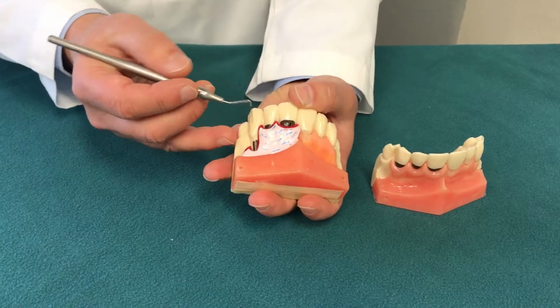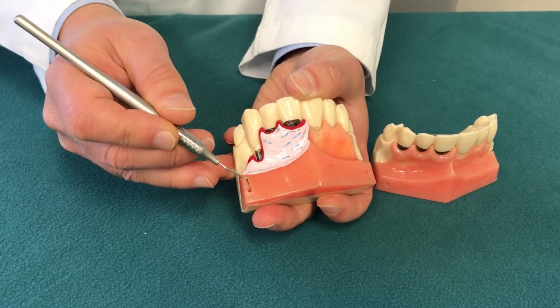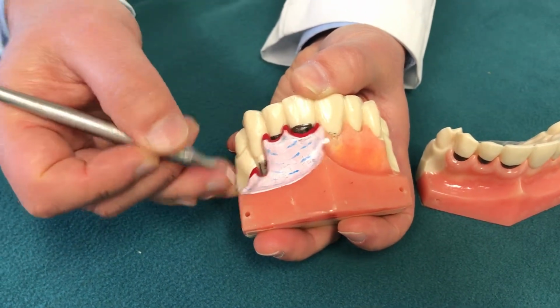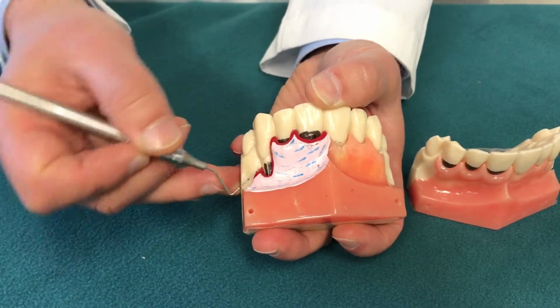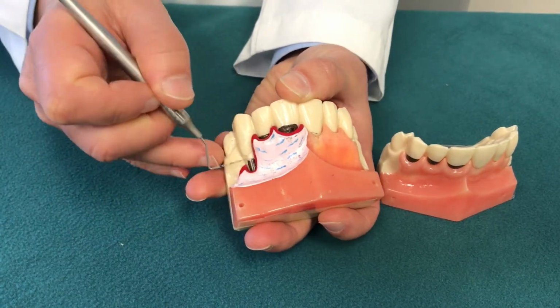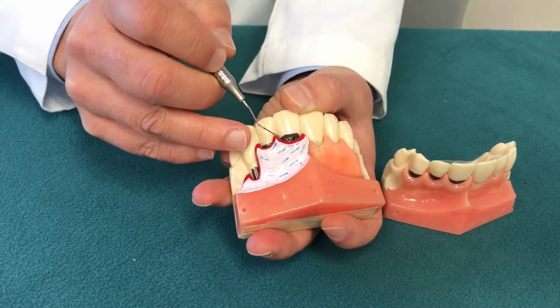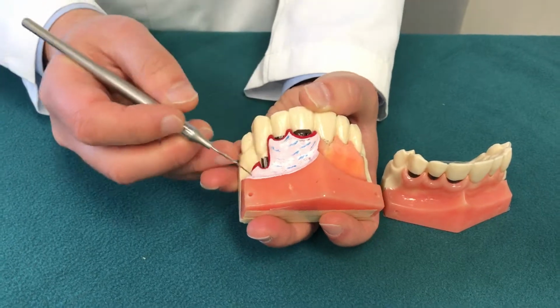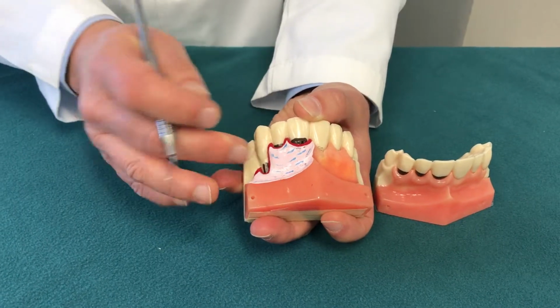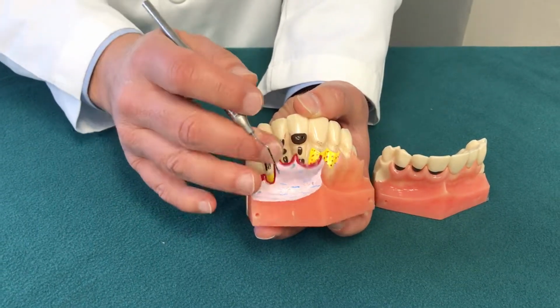The other method, which is rather non-invasive, is called the pinhole surgical technique. We put a hole the size of this one here, or this one, on both sides here, and we open this area by just undermining this tissue and doing a tunnel procedure and lifting up the gum from the bottom up, and this whole thing is going to lift up here, not over here, not over here. It's just going to lift up. So there's no incision involved, most of the time no suturing involved. That way we can put membrane through these holes and cover these receded parts.